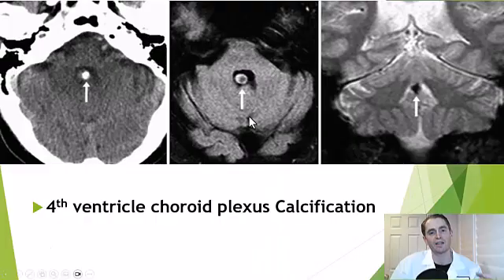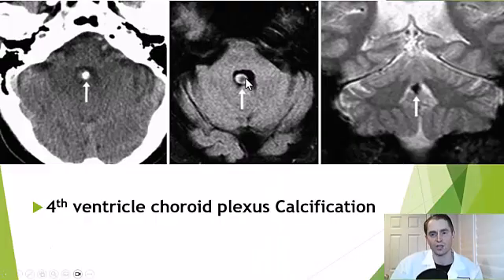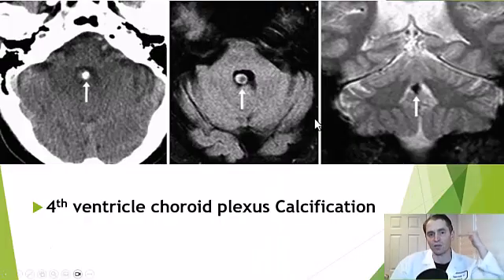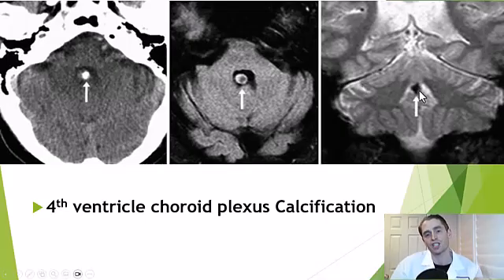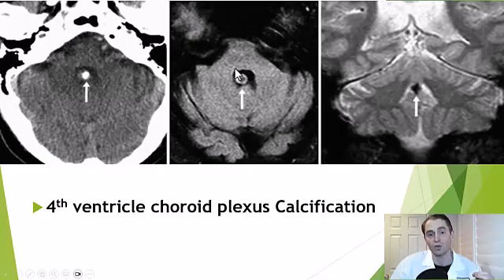You can also get them in the fourth ventricle. These are axial images down low — this is the pons and the cerebellum. Here you can see a CAT scan, and the right two images are MRI scans showing calcifications of the choroid plexus of the fourth ventricle, which is this fluid-filled space.